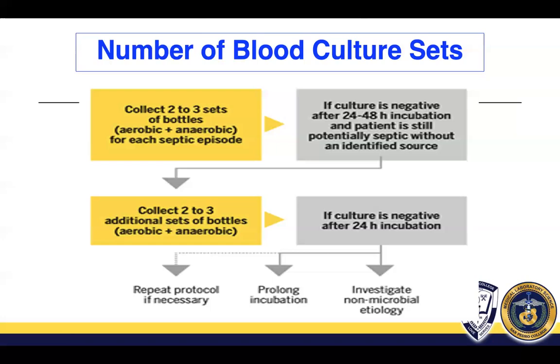So that's how many sets you're supposed to collect. 2 to 3 sets per septic episode. If it comes out negative, you can collect again and incubate again. And if it comes out negative, try and get the help of the physician.